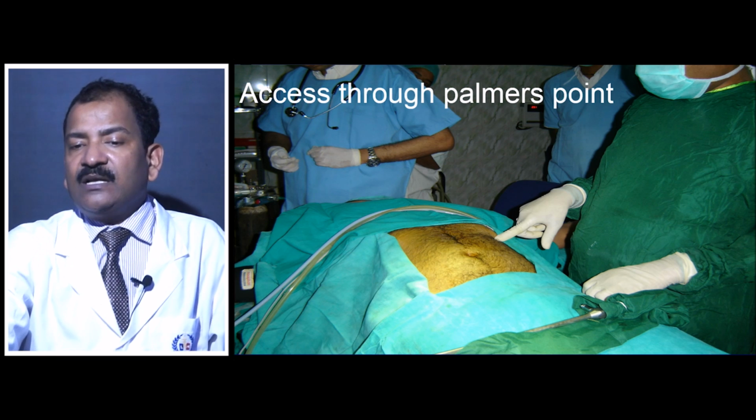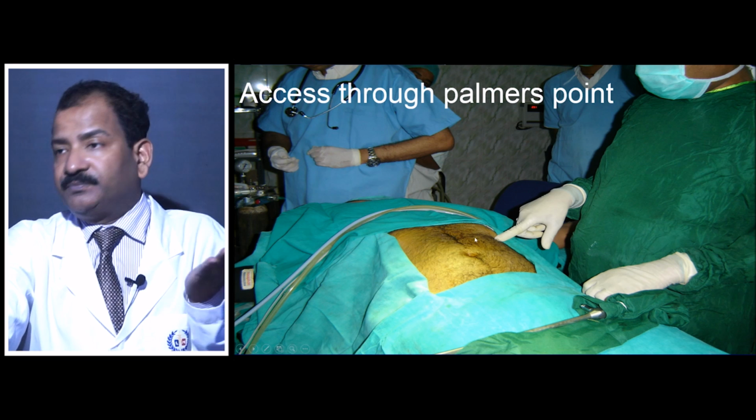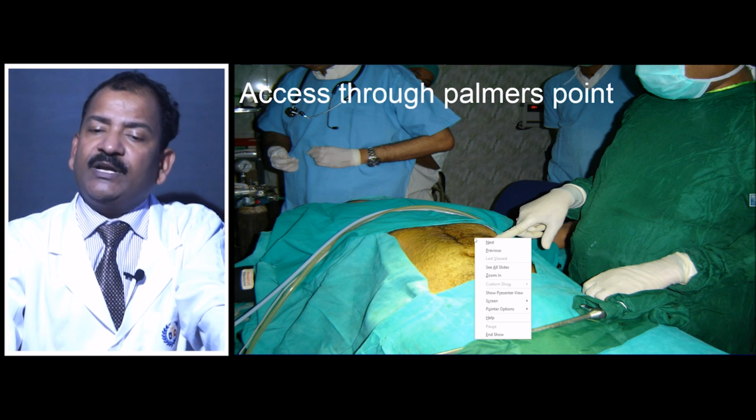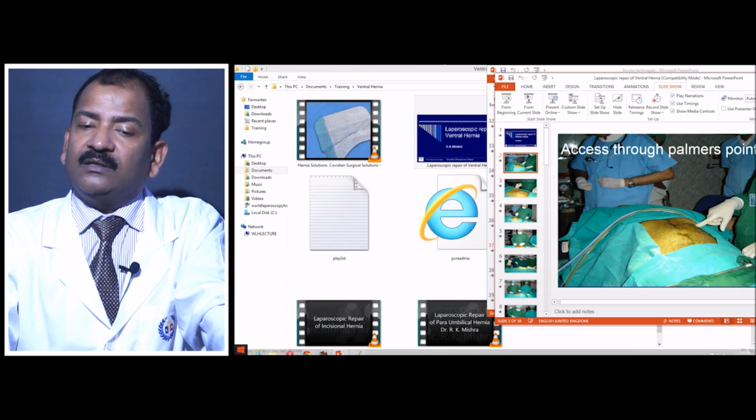The second advantage is that the costal margin keeps this area lifted up. The third advantage is that the stomach is a beautiful organ to perforate. If you perforate the stomach, there will be absolutely no problem. Do you know why? That is why transgastric cholecystectomy you can do.